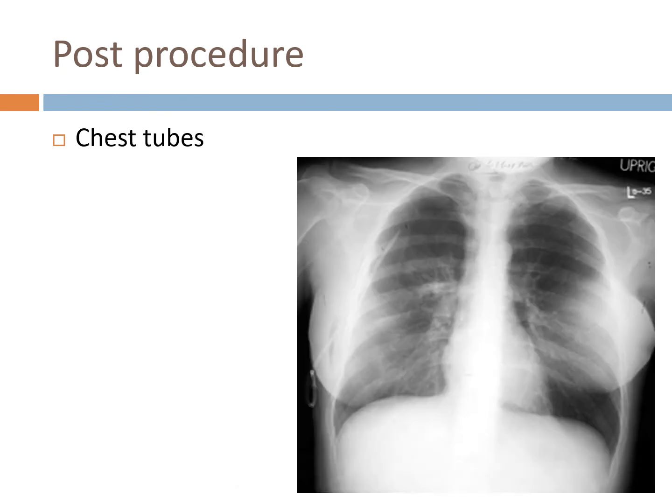Again, chest tubes, making sure that the lung has reinflated, or at least somewhat improved. It's not going to necessarily reinflate immediately, especially if there's fluid in there that they need to drain, but just to make sure that the chest tube's been inserted in the right place.